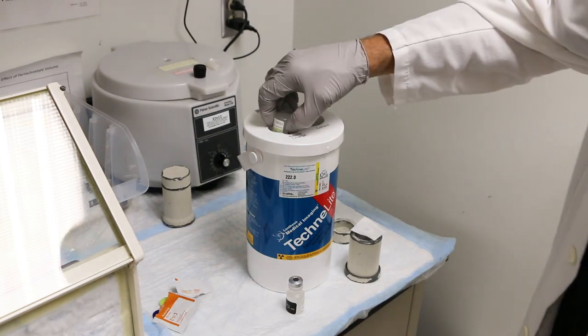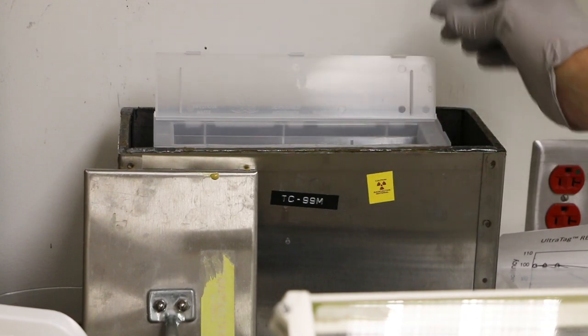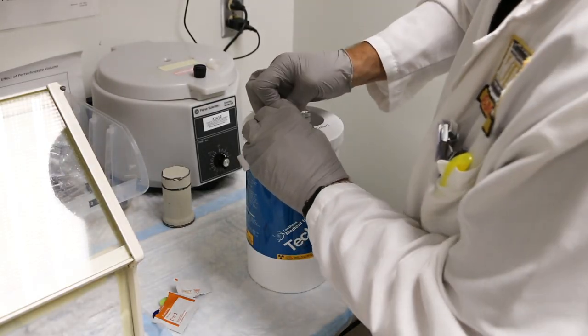Remove the old saline charge vial by pulling, not twisting, the vial and dispose of in the hot trash. Place the new saline charge vial on the generator by pressing directly down.